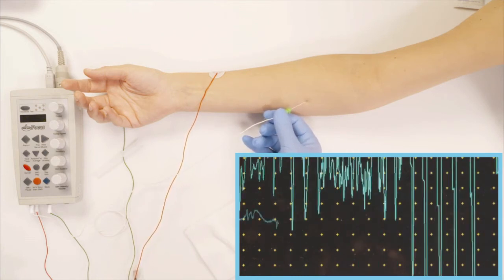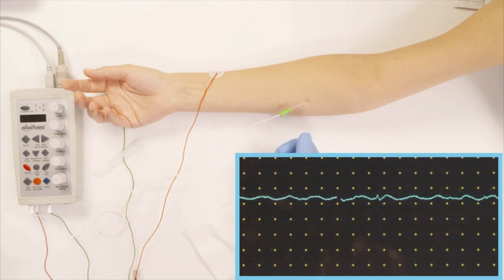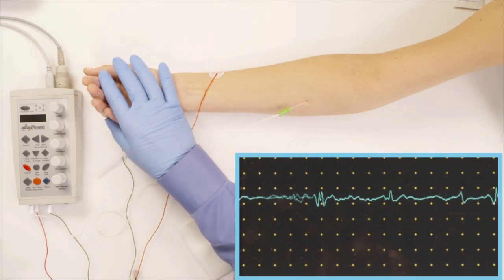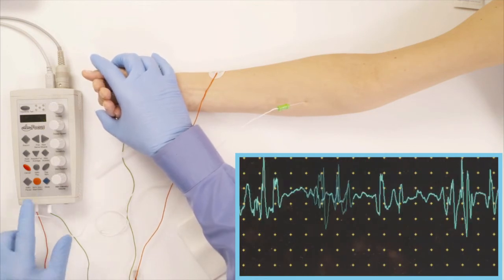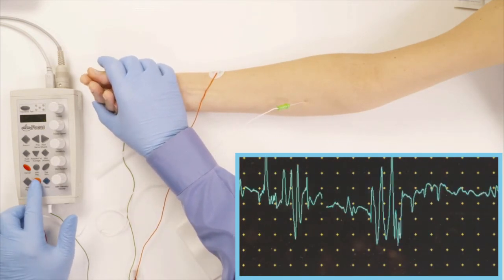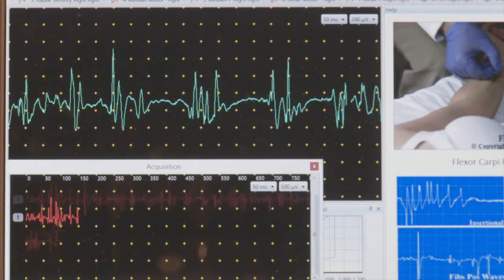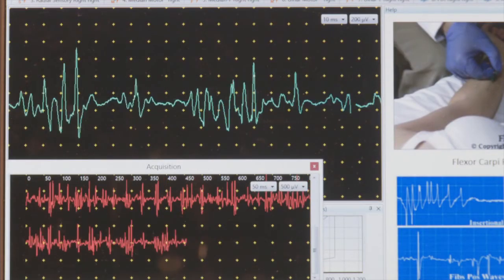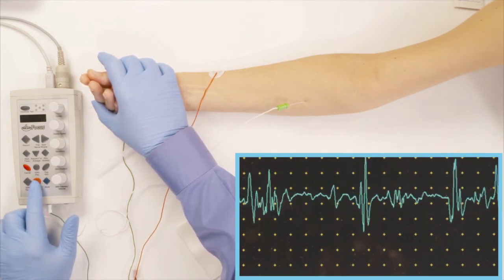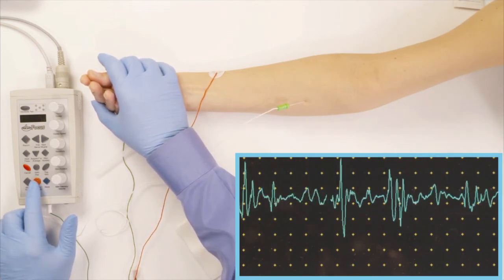The next step is to actually have her activate the muscle slightly. Go up just a little bit with the thumb, very good. Now slight, not much. You can see where the dots are falling in the cloud.